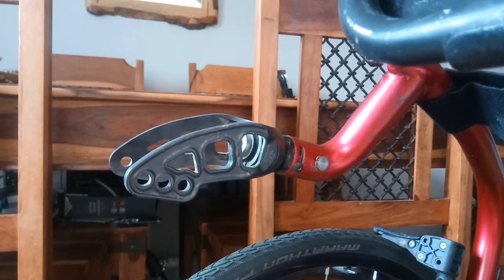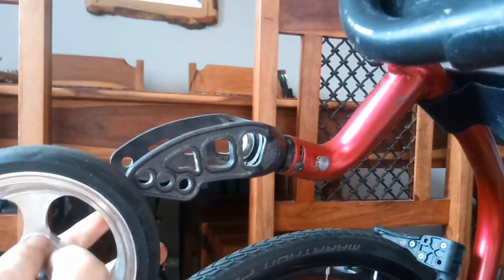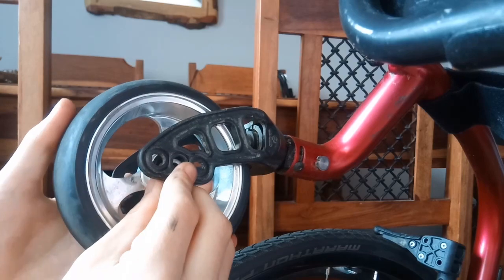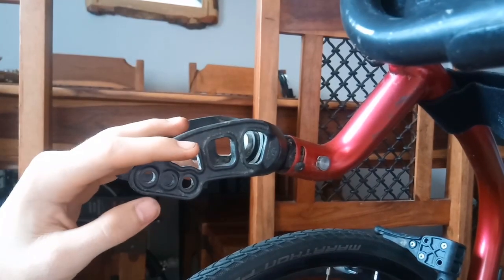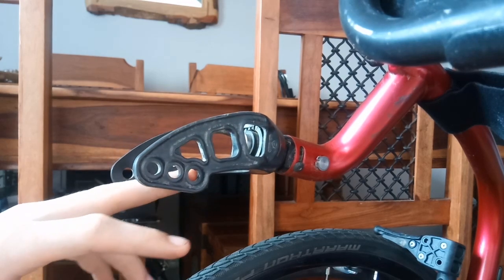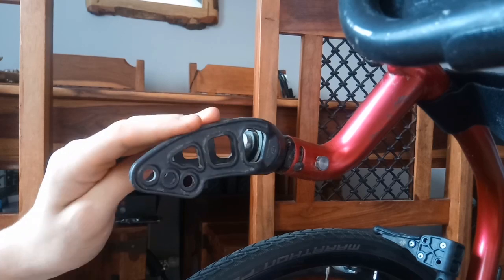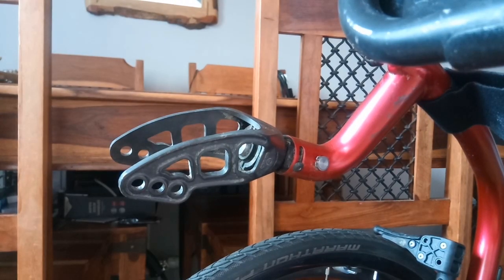Now, first thing you want to do is put it in. So you get your two washers, okay, and then just sort of line them up. It doesn't matter too much just yet how accurate they are. And another thing is make sure that you only do one at a time, because then you can realise what hole you're putting it in. Obviously these aren't perfectly clean, so you can tell that this one is the one that is cleaner, so I should be putting it in that one. So this middle hole is the one that I'm trying to get it for.